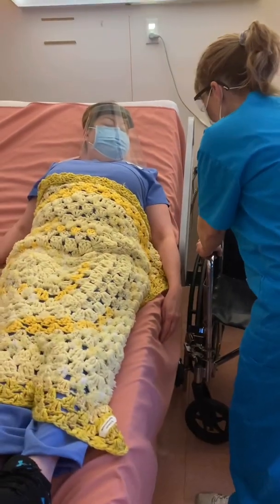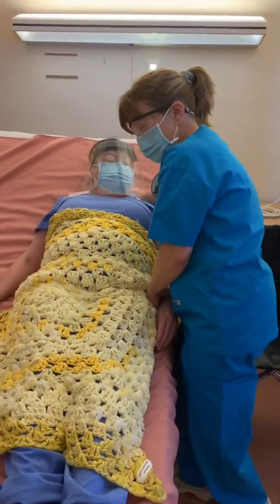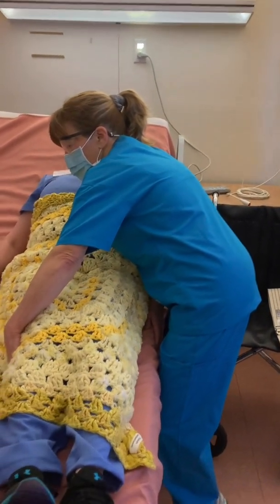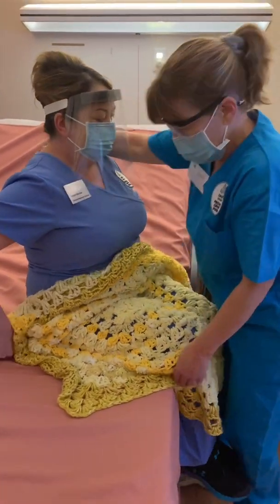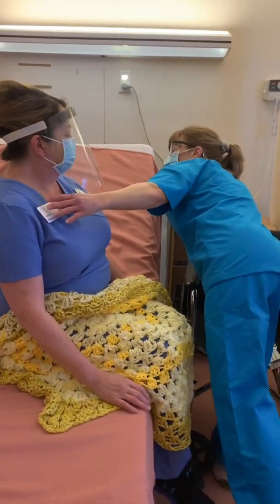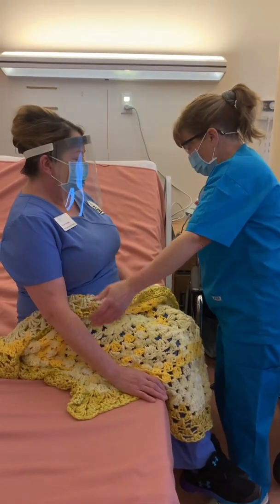So what I would like you to do is, I'm going to put my hand in here, and I'm going to get you to slowly lean forward and move your feet slowly to the edge of the bed where you're comfortable. How do you feel? Fine. Okay, so I'm going to lower the bed so your feet hit the ground. Okay.